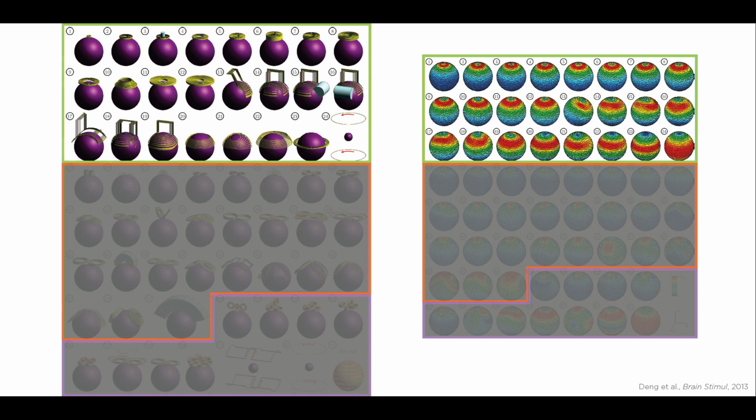Included in the circular type coils are the so-called deep TMS coils, or the H coils manufactured by Brainsway. Coil number 14, for example, is the H1 coil, which has been FDA approved for the treatment of depression. And you can see that many of these H coils also produce a circular type field pattern in the brain, as illustrated by computer models on the right-hand side.